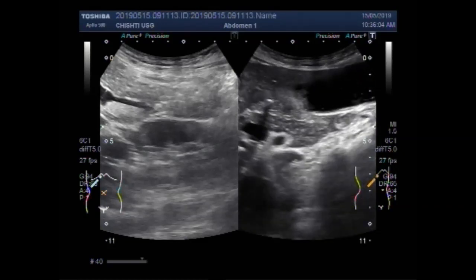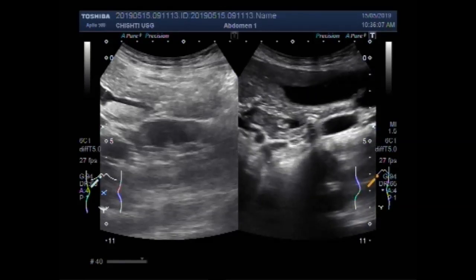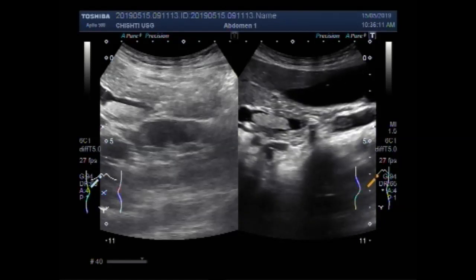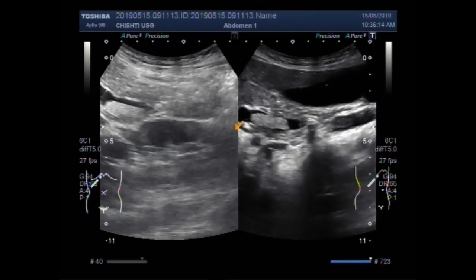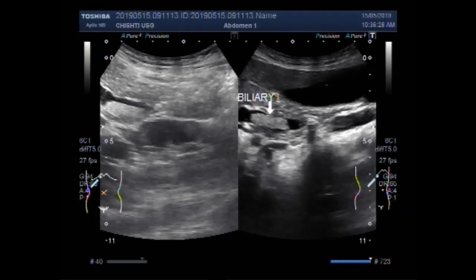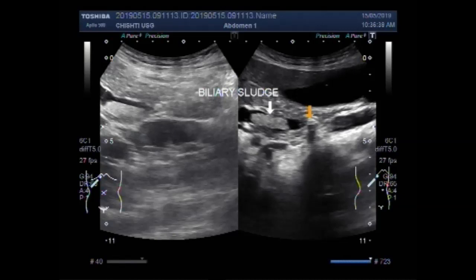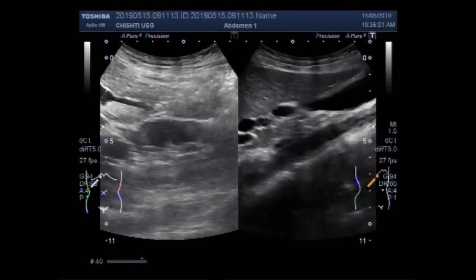Now you can see the biliary sludge and stone in the bile duct. You can clearly see the shadowing of the stone in the bile duct. This is the sludge in the bile duct. And this one is the stone shadowing seen in the bile duct — you can clearly see the shadowing.